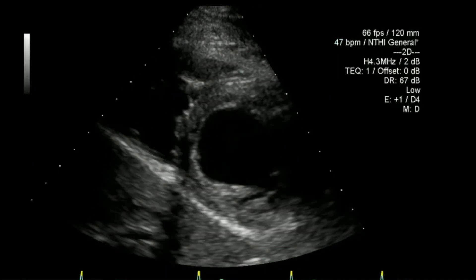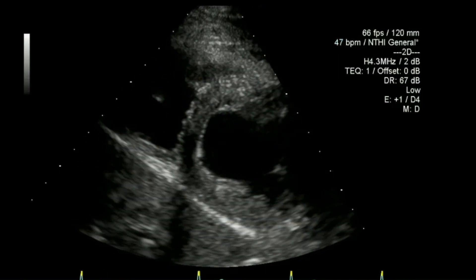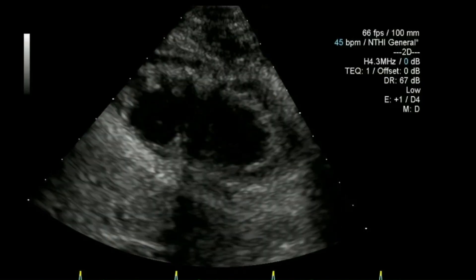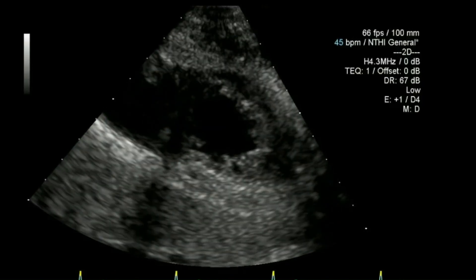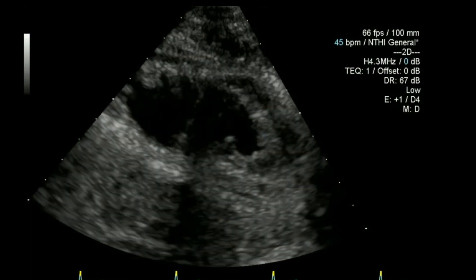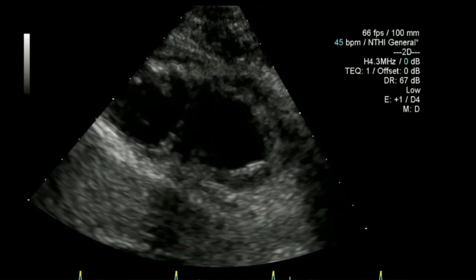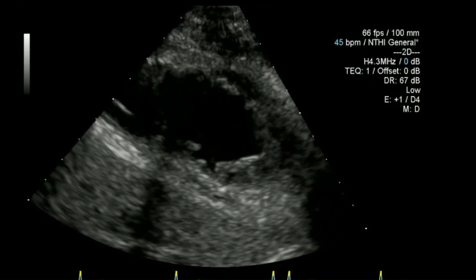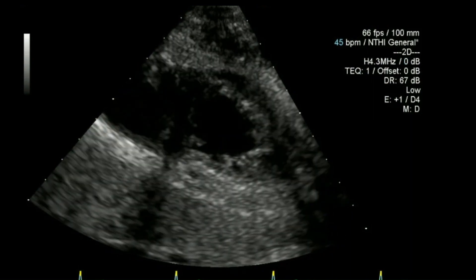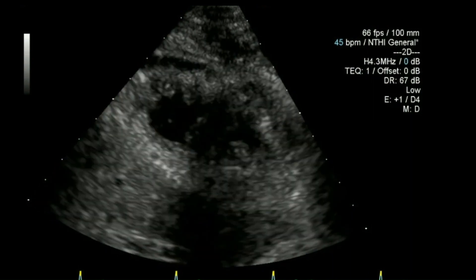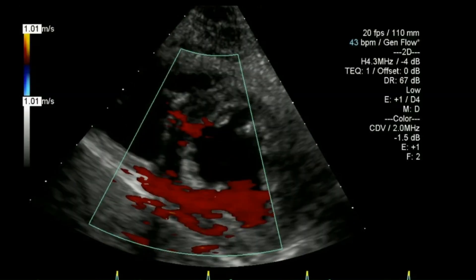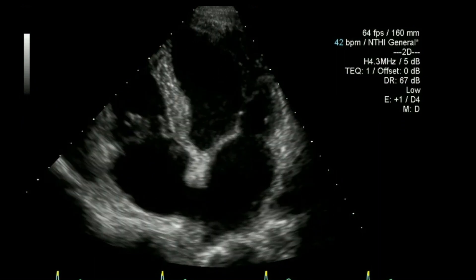Continuing down looking at different levels, generally adjusting my depth as I go — right down towards the tip of the apex, as close as I can get, also including the right ventricle so I can see any pericardial fluid or anything else around either chamber. From here I'll put colour flow on just to demonstrate there are no ventricular septal defects.